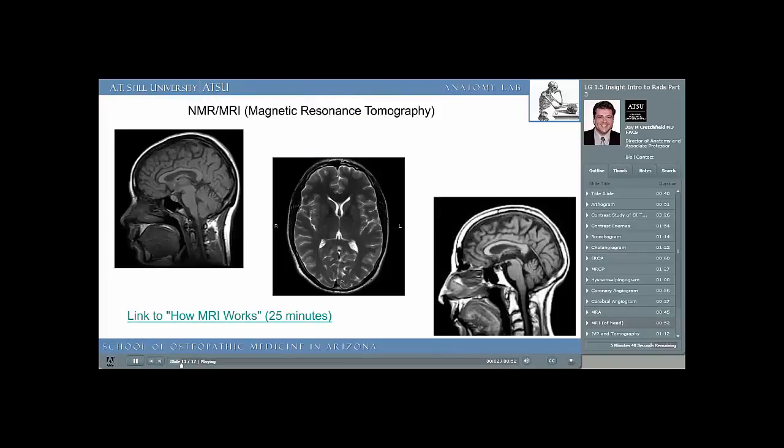Of course, if the MR scanner can give spectacular images of the cerebral vasculature, we would also expect spectacular images in cross-section of the human brain. Here we see sagittal and transverse images of the human brain. Depending on the strength of the magnet, if you'll recall measured in Teslas, we can obtain spectacular images of the human brain in cross-section. As the scanners become better, use stronger magnets, faster computers, and intravenous gadolinium contrast, the images we obtain are truly spectacular and mirror those you'll find in your anatomy atlas.